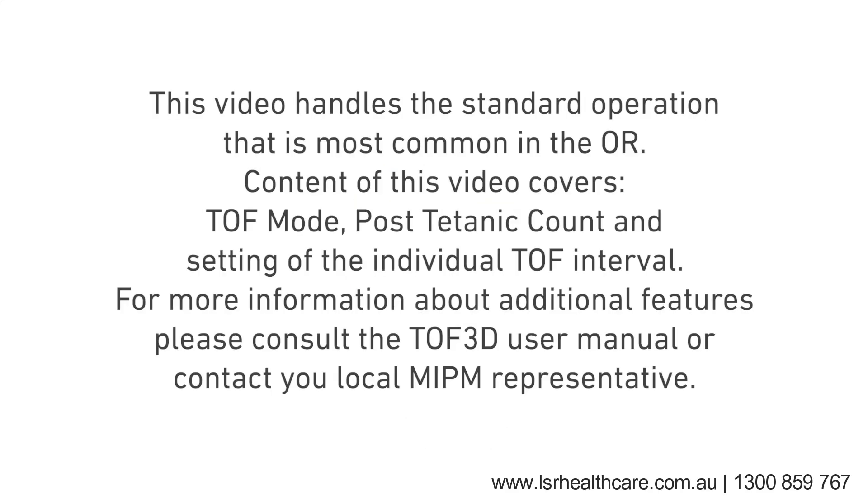This video handles the standard operation that is most common in the OR. Content of this video covers TOF mode, post-tetanic count, and setting of the individual TOF interval. For more information about additional features, please consult the TOF3D user manual or contact your local MIPM representative.